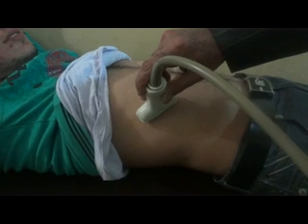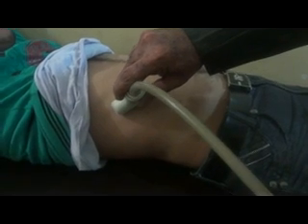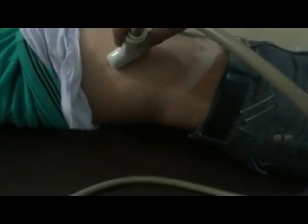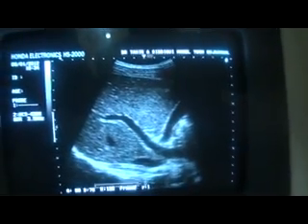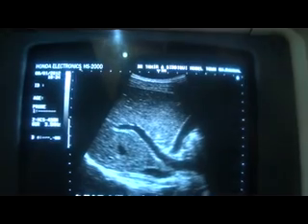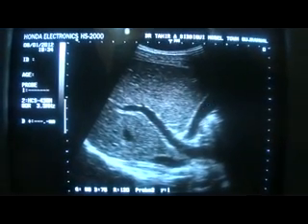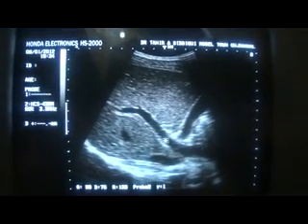I will show you the scanning plane once again. I am in the intercostal space with the patient lying supine, angling the probe towards the left and coming down a bit to get as much of the gallbladder as I can. With this probe maneuvering, I get a view of the gallbladder and the portal vein at right angles to its neck region.